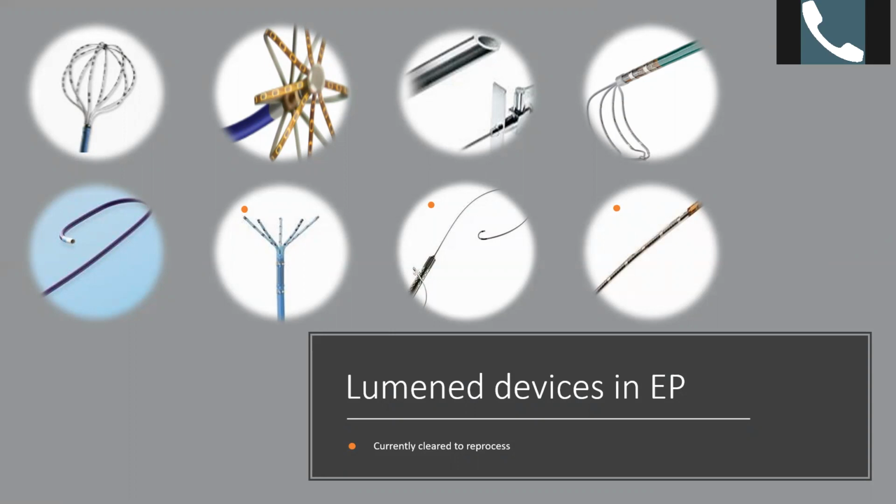Reiterating what Aaron mentioned, when we design the process to clean and disinfect these lumen devices, we also make sure that, one, it is clean to ensure safety, and two, that it still maintains the functionality and performance that's intended by the original manufacturer, but mainly to ensure the safety and effectiveness of that said device. So we take these as our design input, and then we turn that into our design outputs, which is the performance and the usage of the device.